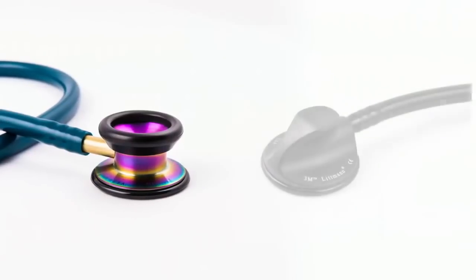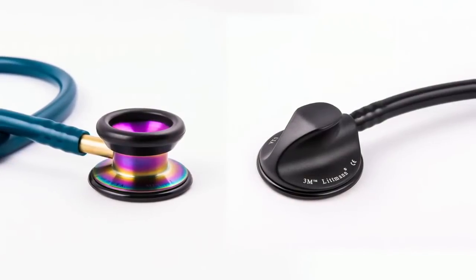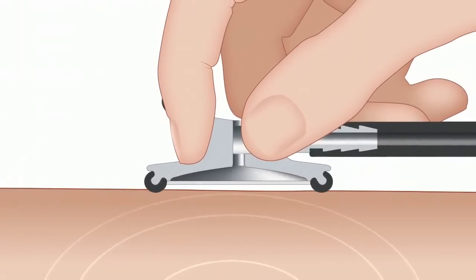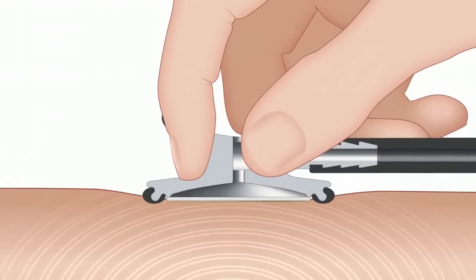Most double-sided and all single-sided Littmann chest pieces feature a proprietary tunable diaphragm. This technology allows you to tune to the sounds you need to hear simply by adjusting the pressure: light for low-frequency, firm for high-frequency.